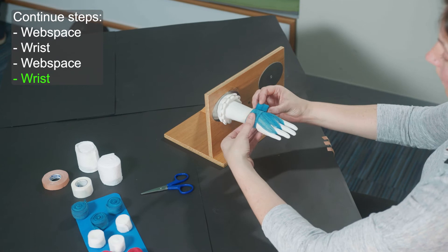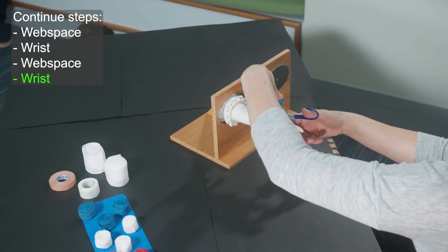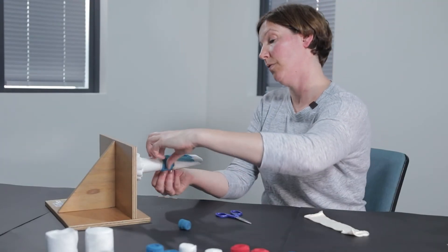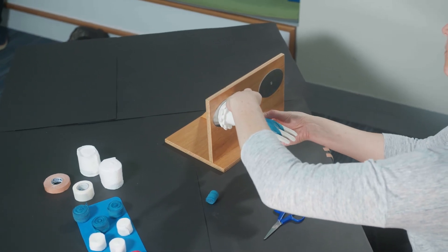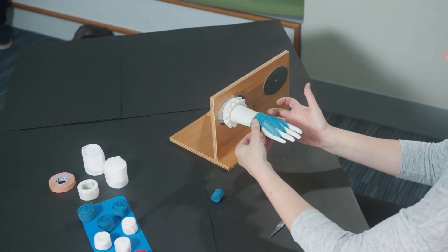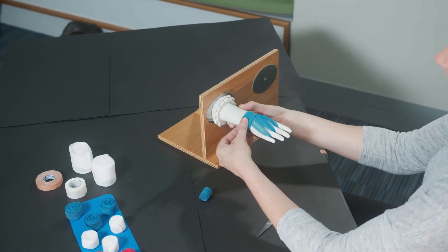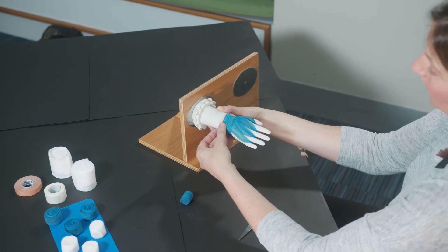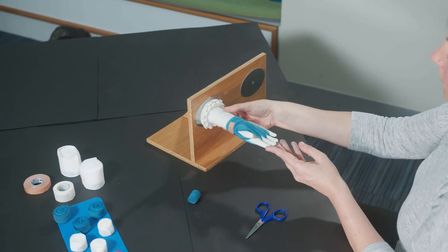We're going to stop here — if your child would like to have their fingers free to play and explore, then what you'll do is just cut your bandage and put a little piece of tape. Let's have a look at the front and the back: this is how it looks at the back, around the thumb, and at the front.